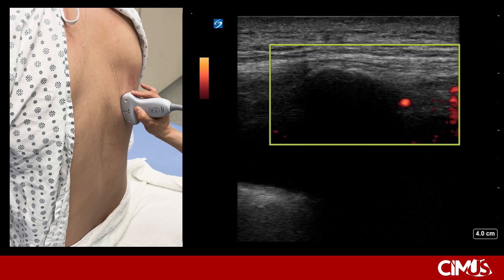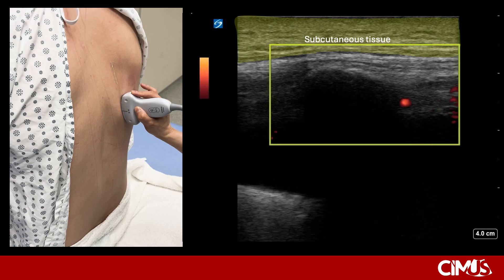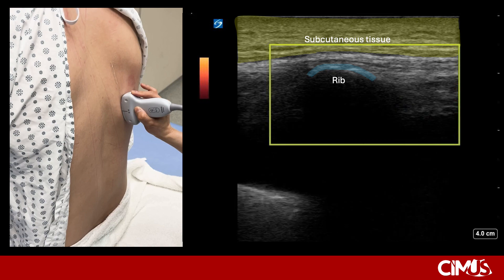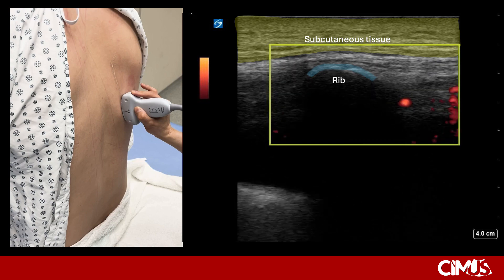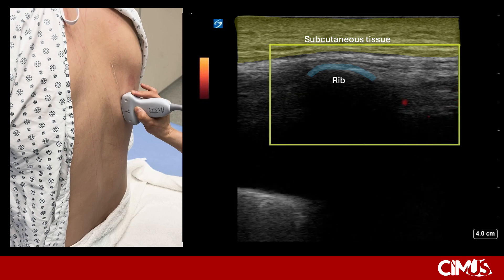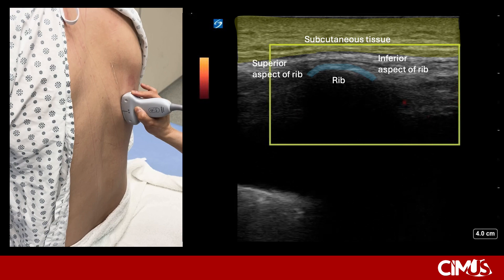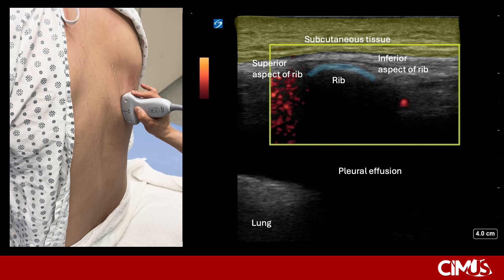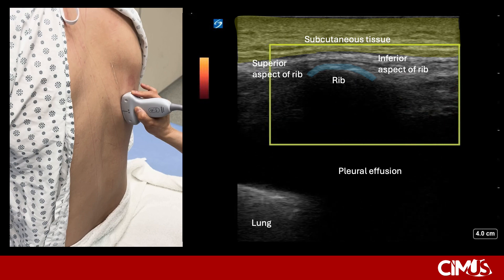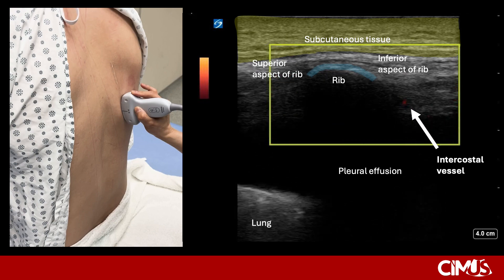The image on the right shows what you might see on ultrasound. Here you can see the subcutaneous tissue. Beneath this, you will see the rib, which will typically appear as a bright, rounded hyperechoic line with posterior acoustic shadowing behind it. We have outlined the superior and inferior aspect of the rib. Here you will see a pleural effusion as well as the lung tip within the effusion. Just inferior to the rib, to the right of the rib on the image, you will see an intercostal vessel picked up on power Doppler.